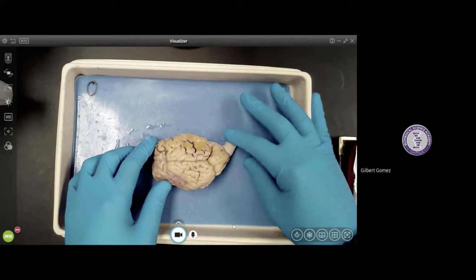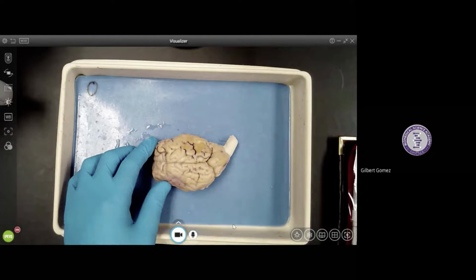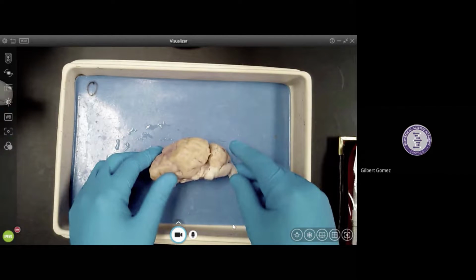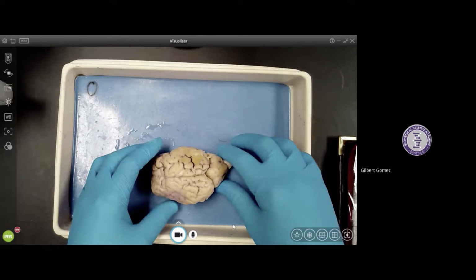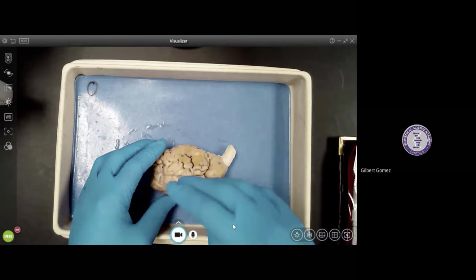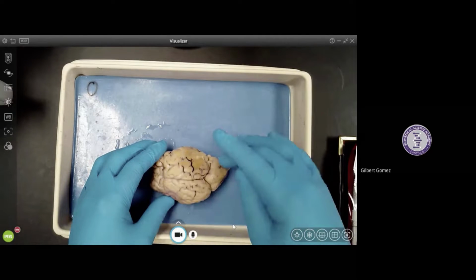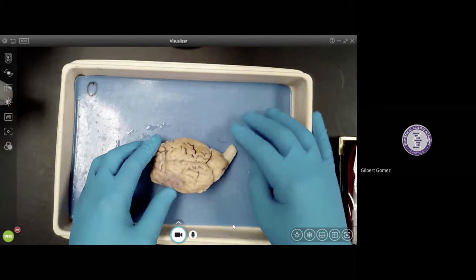Good job. So in a human, because we stand up on two legs, the spinal cord actually comes down like this out of the bottom of the skull. This one's going to come out of the back of the skull because it's a quadruped, which means that it is on four legs where we're bipedal. And so this is going to be one of the major differences. Okay.